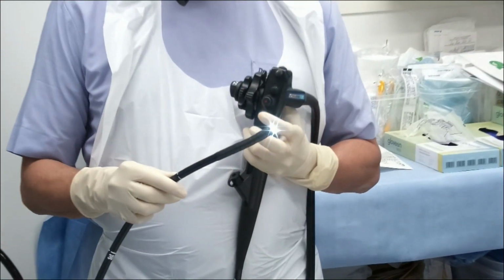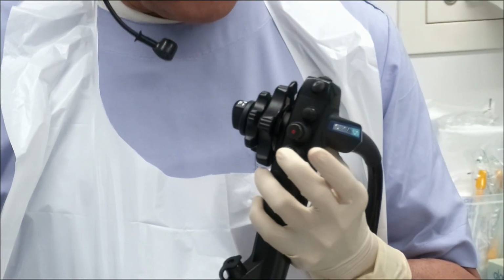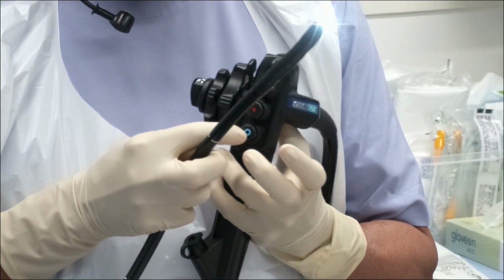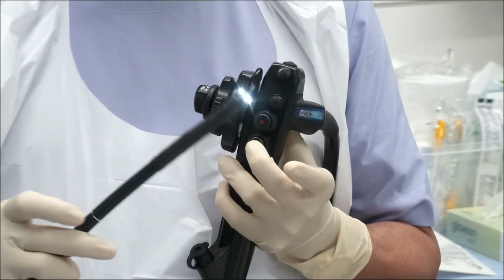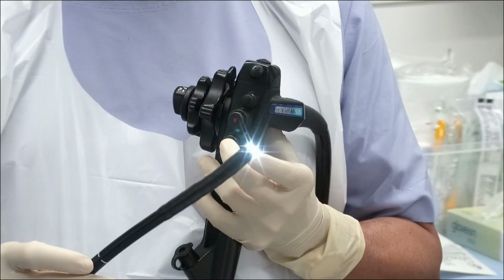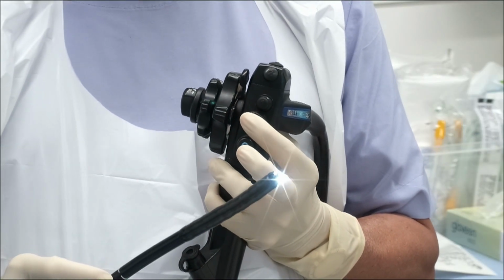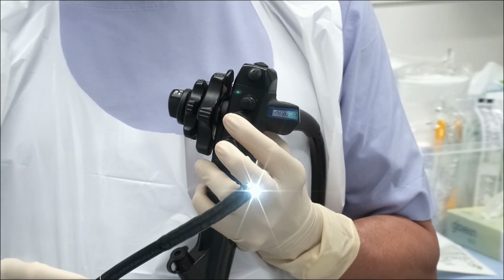When you are doing the endoscopy, our left thumb always remains on this button, so that the hole at the tip gets covered and the air gets transmitted to the tip of the scope, and that air goes inside the stomach. Whereas the upper button is the suction button, by which you can suck the fluid which is there inside the lumen.